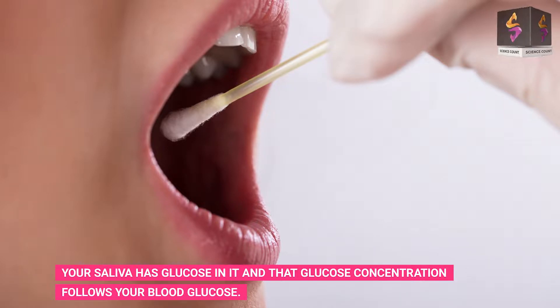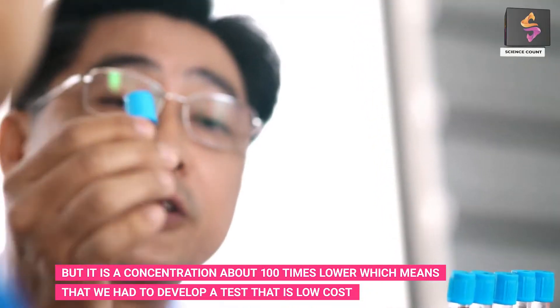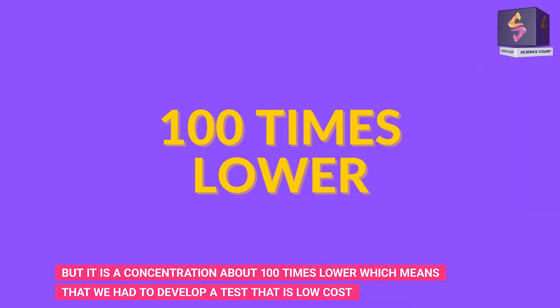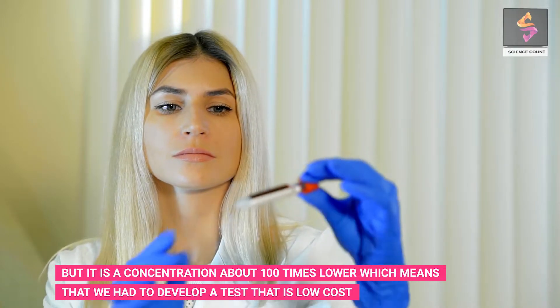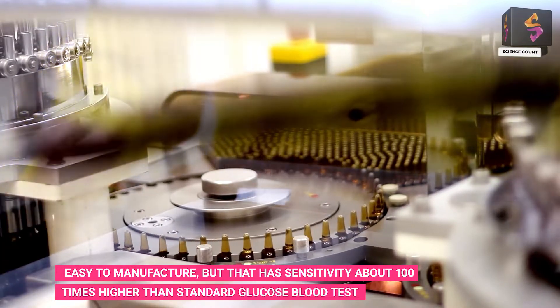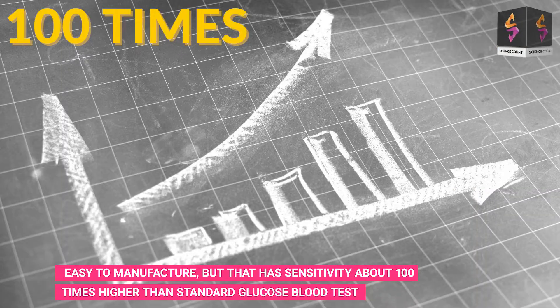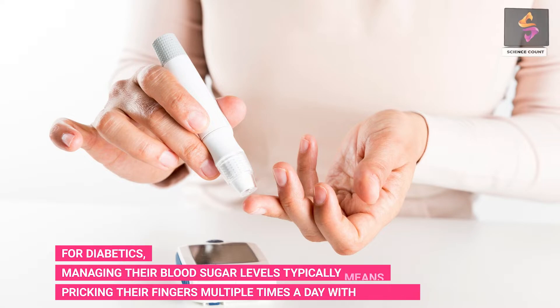The saliva glucose concentration is about 100 times lower than in blood, which means scientists had to develop a test that is low cost and easy to manufacture, but with sensitivity about 100 times higher than a standard glucose blood test.